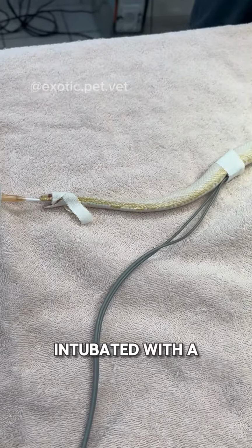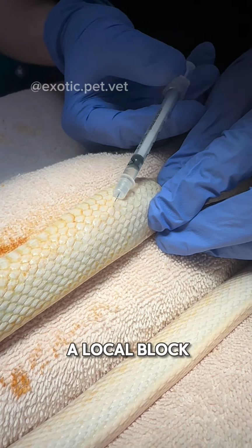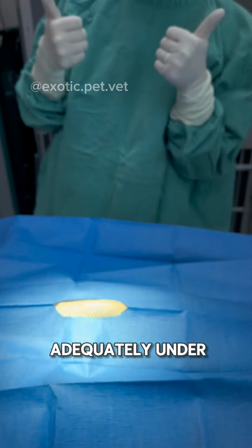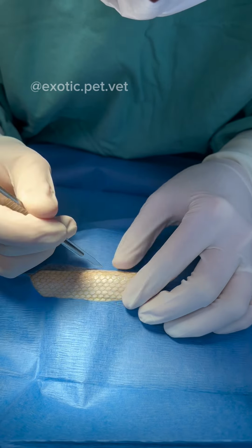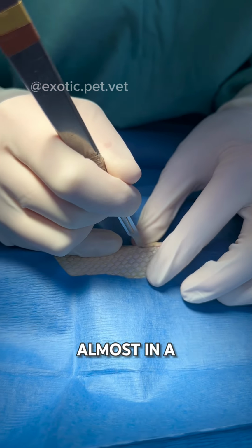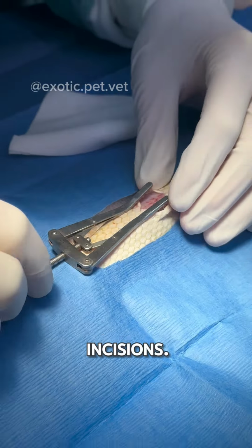Here she is intubated with a tiny little catheter and all hooked up to her monitoring. I gave her a local block, which numbs the skin over where my incision will be. Once she was adequately under, it was time to begin. When making an incision through snakeskin, it's important to try and go between the scales, almost in a tiny zigzag. I used this device to keep the skin parted while making deeper incisions.